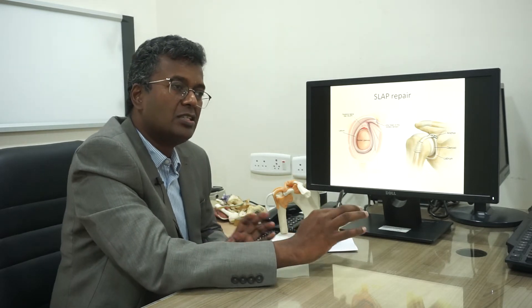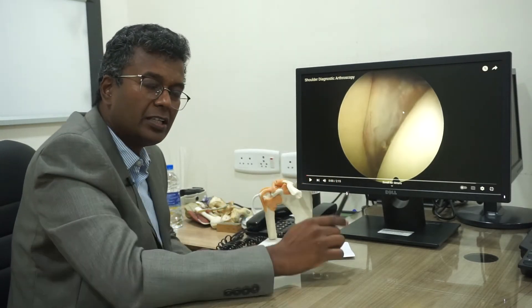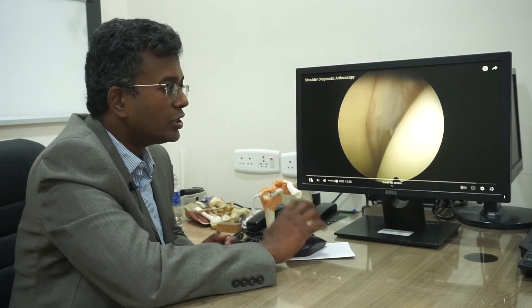There are many surgeries we can perform through keyhole surgery. This is just an awareness video for patients to understand what surgeries can be done through shoulder arthroscopy. Now we will look at the arthroscopic anatomy of the shoulder — what we see through the keyhole.